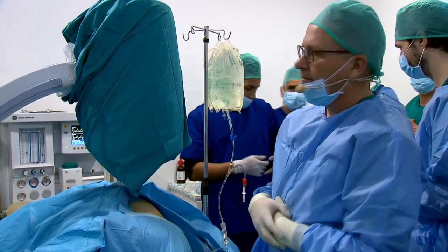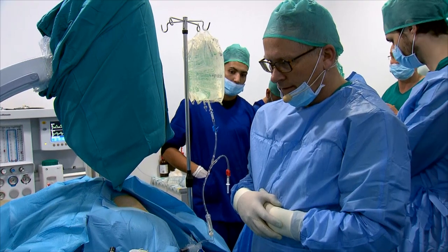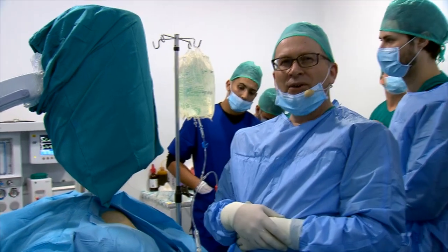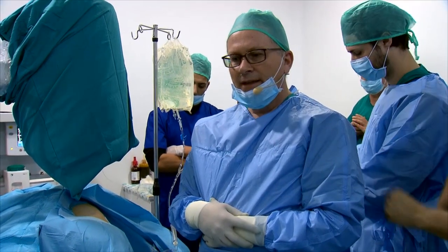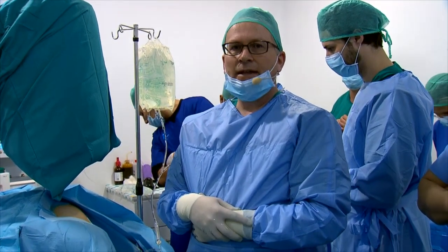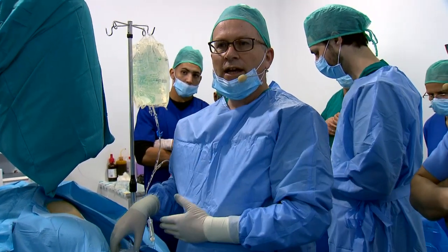I have a question about the dye, the methylene blue. Is it mandatory? Do you always use it, or just for this workshop? I always recommend using the methylene blue because if you lose your contact to the calyceal system, it is always very easy to re-establish the puncture channel. Of course, it can be avoided if you are very experienced. But some of you have residents, some of you are training urologists who have not so much experience. Therefore, from my point of view, it is better to use methylene blue.